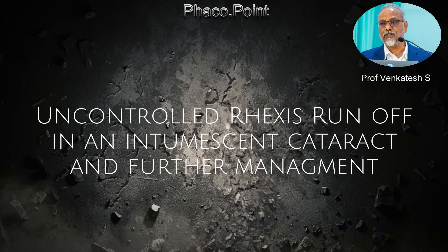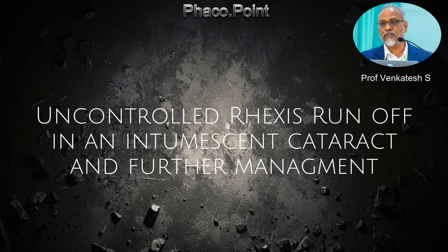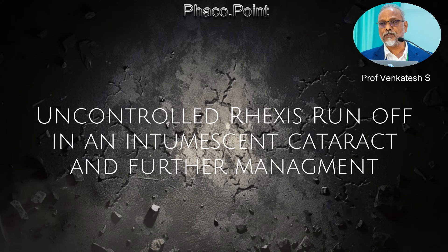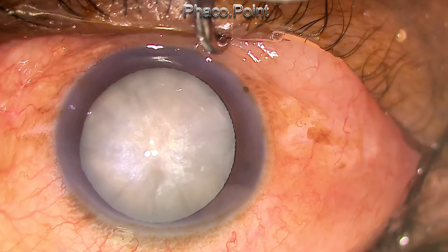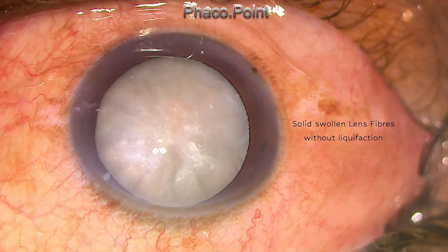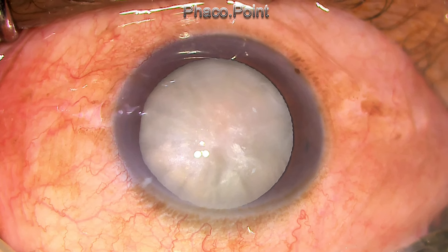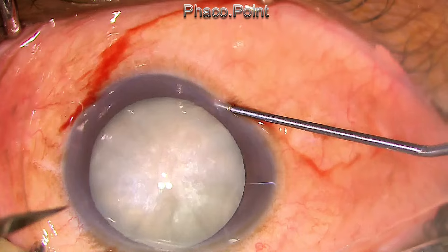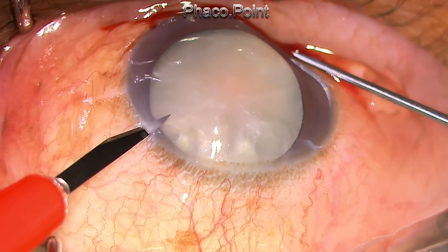Hello friends, this video is about how, in spite of my best intentions, I could not control the runout of the rhexis in an intumescent cataract. This particular case was a 45-year-old male patient who developed an intumescent cataract, probably due to diabetes. The funny thing about this intumescent was that there was no liquefaction of the cortex, but the entire cortex was solid and swollen, as well as white. Now let's go through how I handled this case.